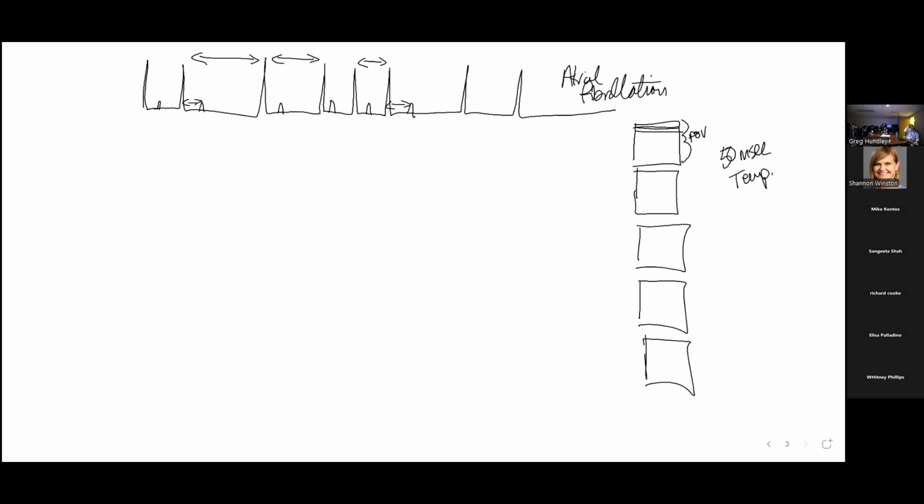So what you can do is you can switch. Here are triggers. You see these. We can simply sample end diastole and just through systole. Okay? And so what happens is you kind of set this up. All these are supposed to be the same.